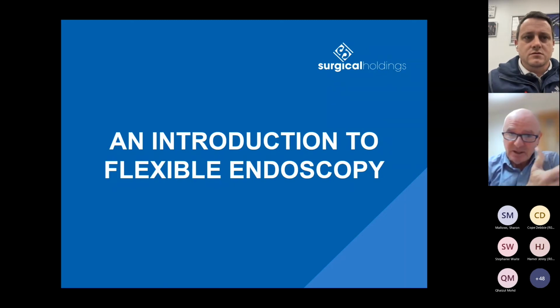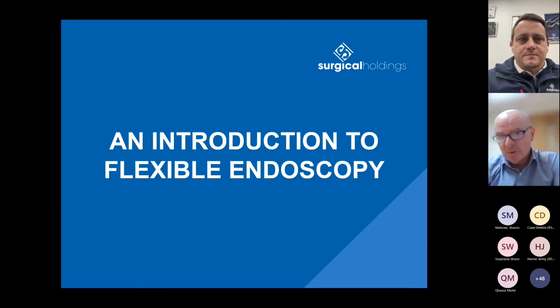With video scopes, it really is the chip. If the chip goes, it can be a real problem. If you take something like the ureteroscope that I mentioned, the flexible ureteroscope that goes into the ureter and the kidney, if you ruin the optical system in that, you're talking pretty well the cost of the instrument. So it's a big problem. Yeah, of course, we're sure we want to avoid that.